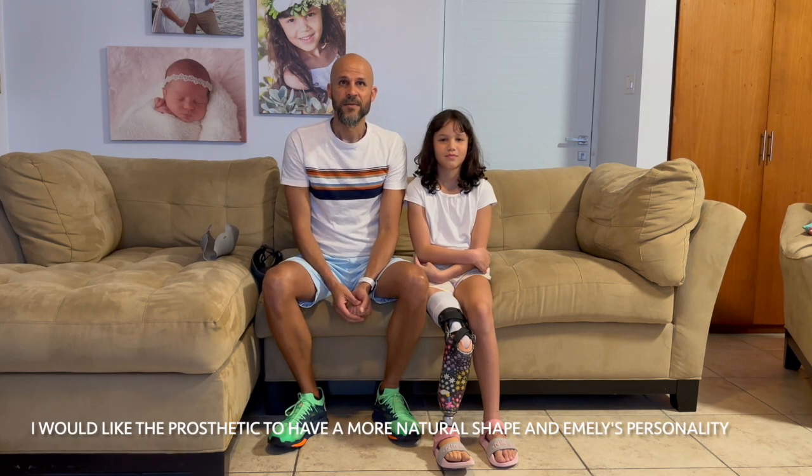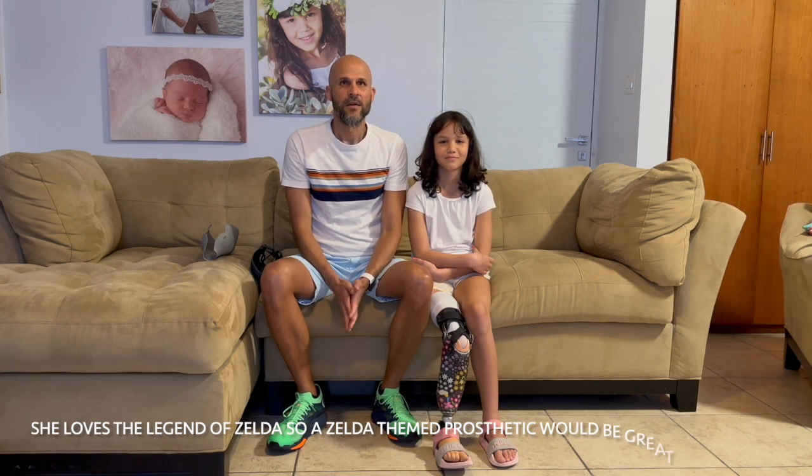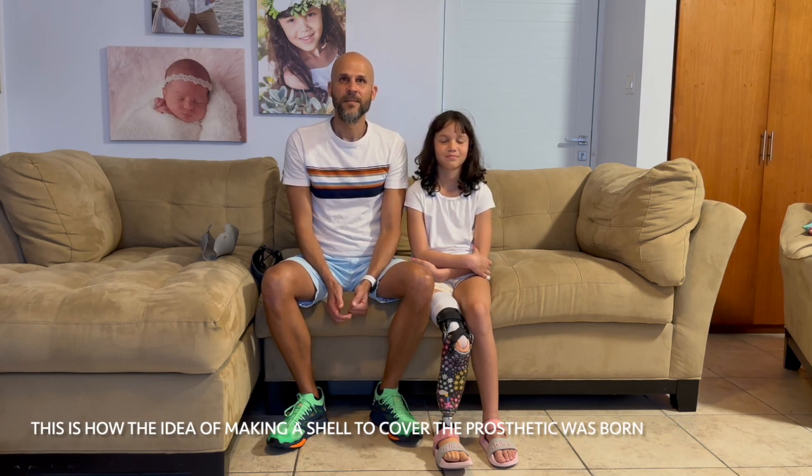I would like the prosthetic to have more natural shapes and reflect Emily's personality, like different colors or things. She loves the Legend of Zelda, so a Zelda-themed prosthetic would be great for her. This is how the idea of making a shell to cover the prosthetic was born.